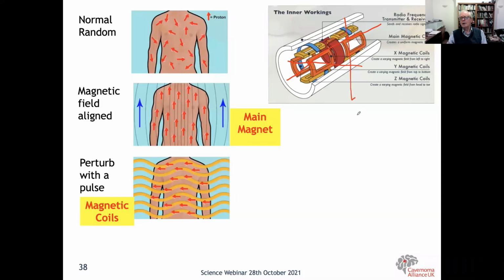So you can do perturbations of the spin that you've got horizontal here, which you can vary as you wish to. And that gives you a lot of ability to modify what you're looking at. And everything is detected by this orangey red coil here, because you detect radio waves going through a coil as well. And so you can see that we've got a massive number of coils in the MRI scanner.